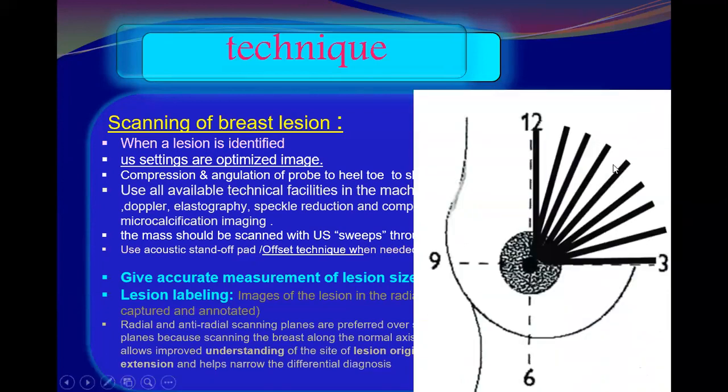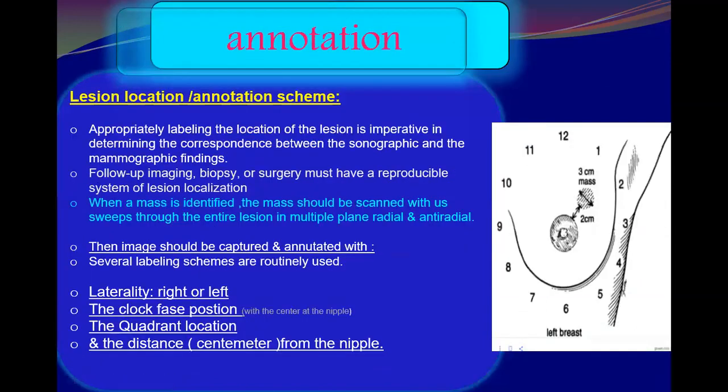Okay, this is the direction of the ducts and the radial view, at the same time showing the clockwise. Okay, we said it is clockwise. Okay, lesion annotation scheme.